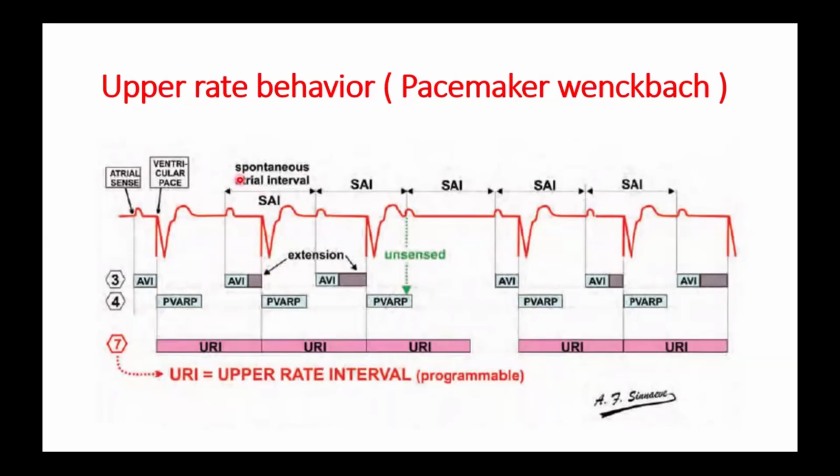so that the heart rate doesn't fall suddenly. Most importantly, the upper rate behavior occurs until the total atrial refractory period. Once the atrial rate is higher than the total atrial refractory period, 2-to-1 conduction occurs immediately.